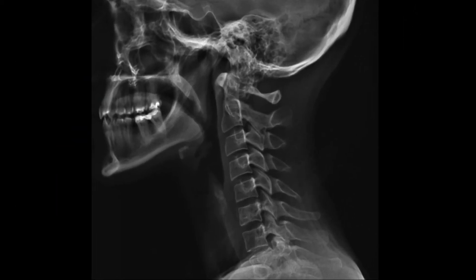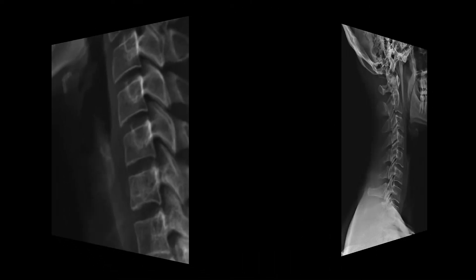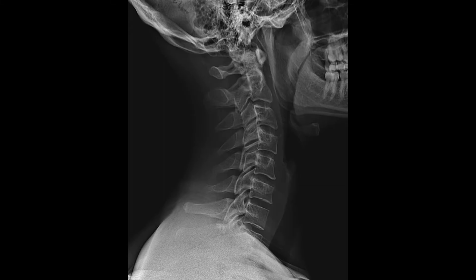Now on to some X-rays. This is a relatively normal lateral cervical view. As we zoom into the anterior soft tissues of the neck, the thyroid cartilage is visible — not very prominent, and that's fine. Sometimes this will show up on an X-ray, sometimes it doesn't. Here is another normal lateral cervical view. We can see the hyoid bone under the mandible and then just a faint little bit of thyroid cartilage calcification.